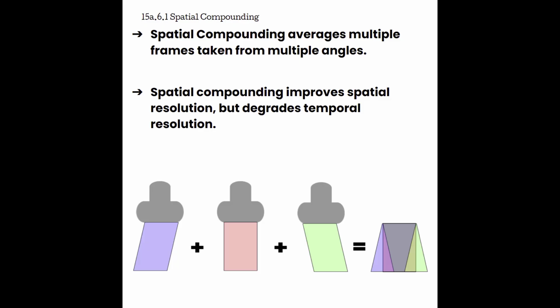And I want to highlight again that this is happening so incredibly fast that really for the most part, we're not even going to notice it. Everything's still going to seem very smooth to us because the machine is very capable of creating these frames very quickly and then adding them together. So we still get that real live imaging effect.